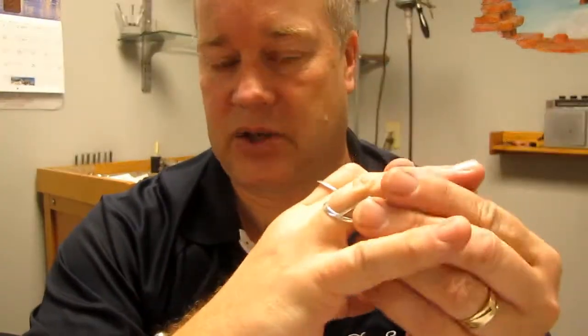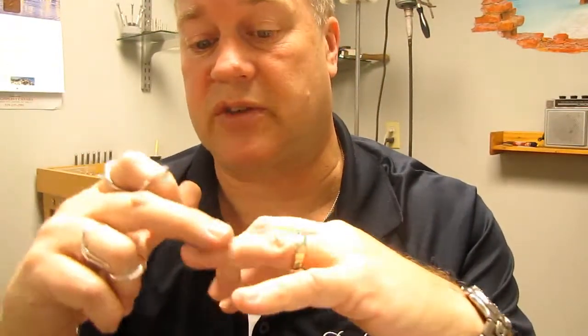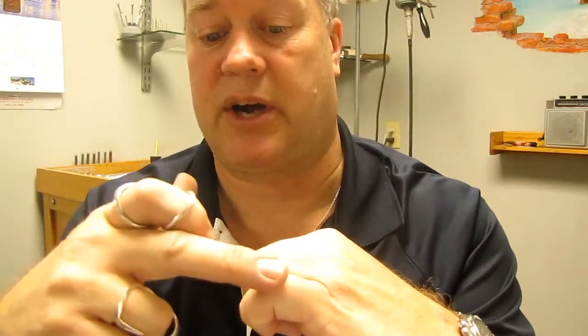We can also add lateral supports for laxity and joint stabilization — for joints that are going side to side. It's very comfortable but creates stability so you have full function while laxity is taken care of. These splints are made for any IP joint of the hand. IP, or interphalangeal, covers the distal IP joint closest to the fingernail, the proximal IP joint, and I can build a swan neck splint for either joint on each finger, including the IP joint of the thumb.